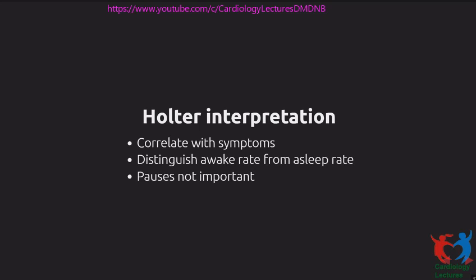Now, the first thing that people report on the Holter is their minimum heart rate and the longest pause. I think that's the wrong way to interpret the Holter. The first thing to see on a Holter is, did the patient have symptoms or not? If the patient had symptoms, report the time when the patient had symptoms and report the rhythm at the time of the symptoms. So if you say that the patient had symptoms lasting about 15 minutes starting at 5 p.m., and this was associated with a drop in his resting heart rate to 35 beats per minute, that is a clear class 1 indication. This is what you should look for in a Holter.